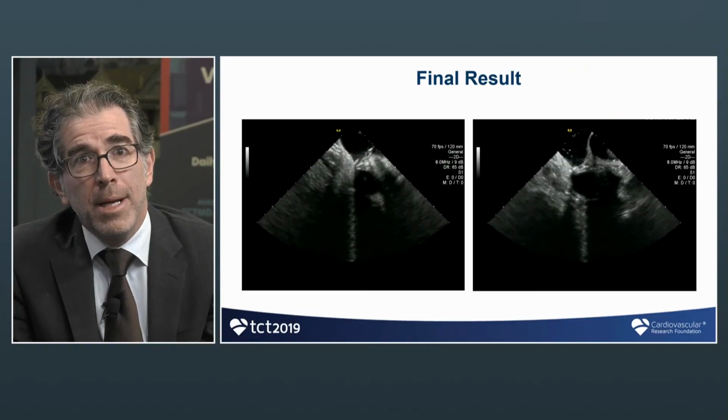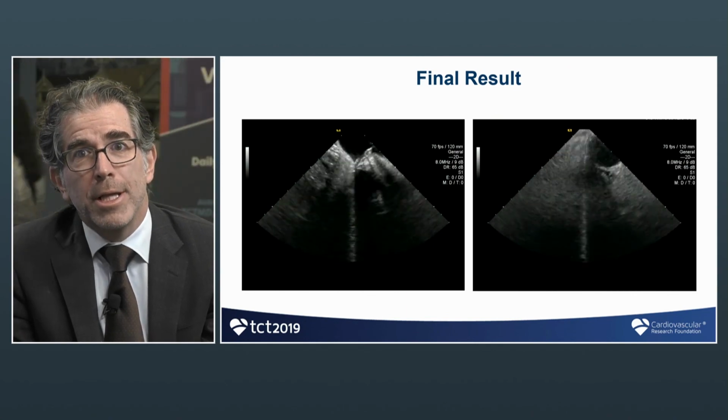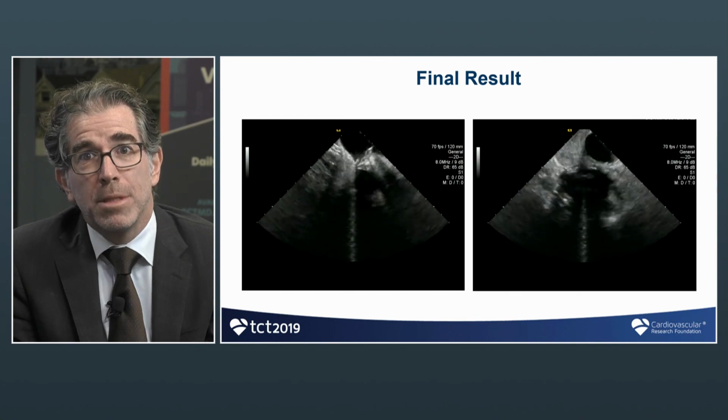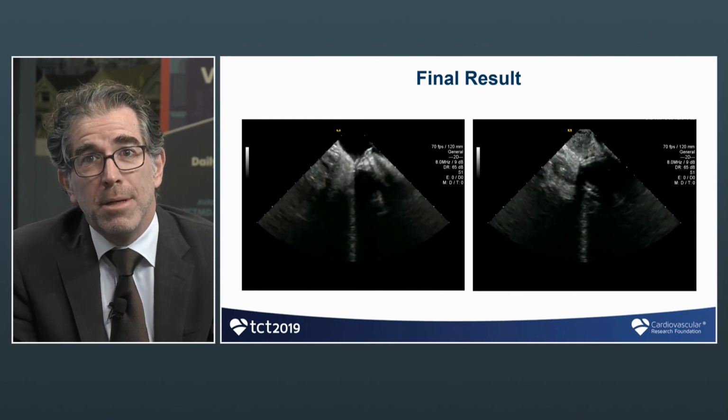In my experience, the combination of this atrial septal aneurysm and a thick secundum is the one that's most likely to still have a positive bubble study. Right. But when it looks like this, you've got a good chance. And here you see on the left the final result by ICE without bubbles, and you see it's quite nice and flat and organic. Look at the short axis, looks really nice, doesn't it? Yep. And there were zero bubbles. Great result. Fantastic. Good. Well, thank you very much.